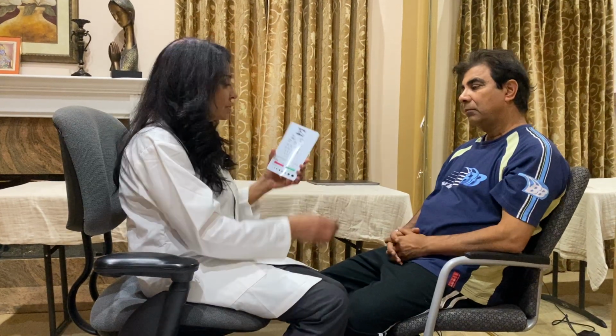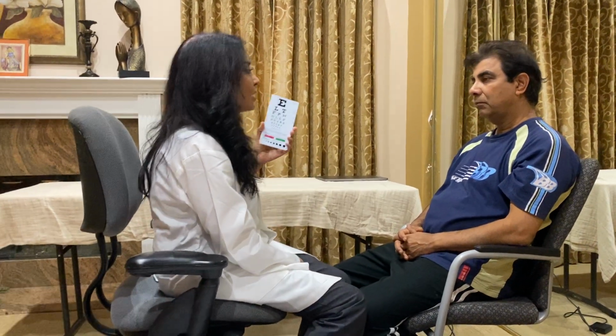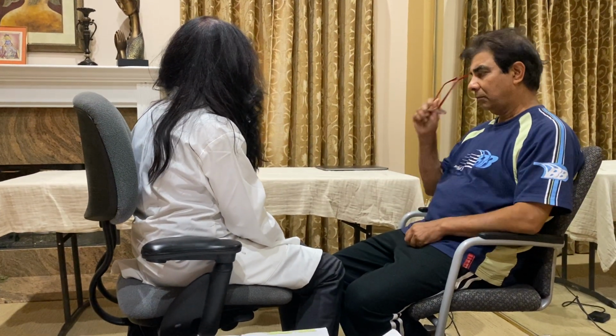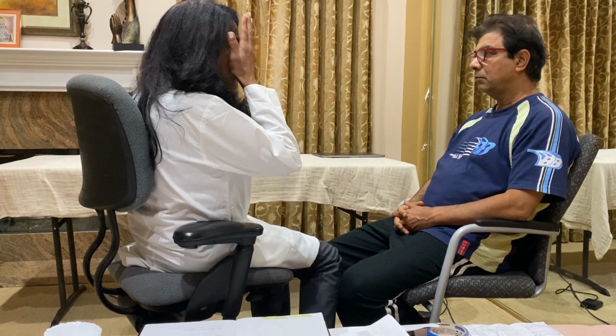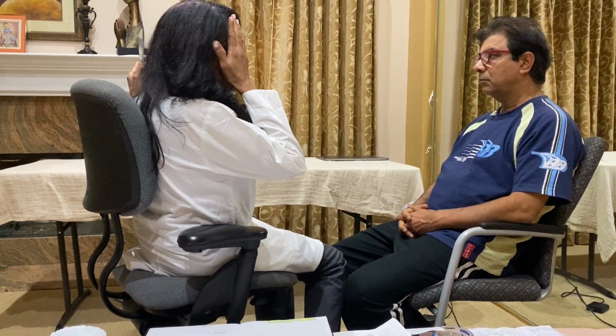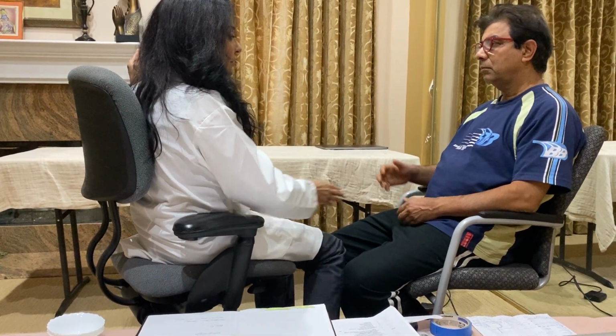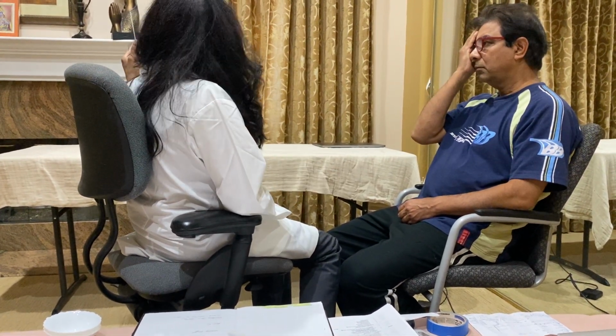Now we're going to examine your eyes. For your eye examination, first of all, I'm going to check your visual acuity. For that, I'm going to get my Snellen pocket chart. I'm going to put it about 6 feet away from you. You're going to cover one eye with one hand. Exactly. And then you start reading from the bottom up.